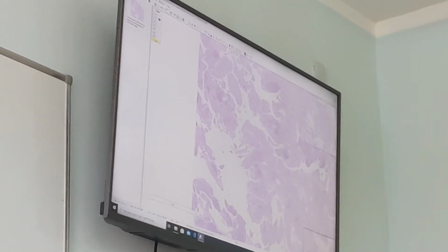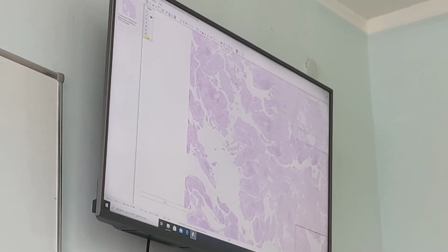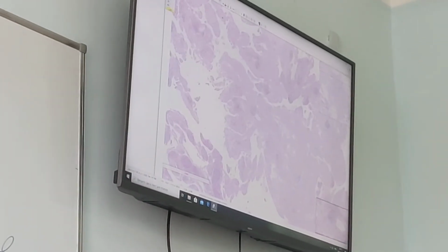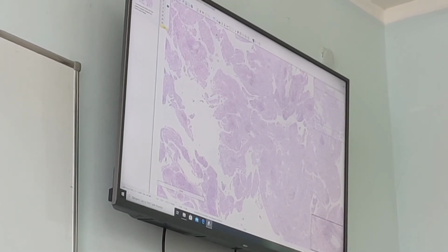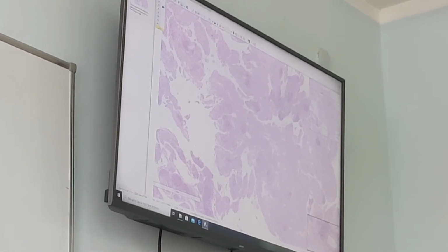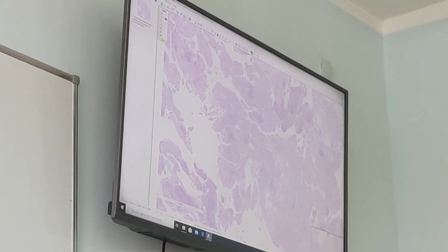So these are increasing, elevated papillae on the surface of the synovial membrane. They consist of these multiplying synovial cells. In normal synovial membrane, it's almost linear in shape, without papillary outgrowth, and only with small villi. In this case, villi are increased, hypertrophied, thickened, and papillary structures can be formed, like here.